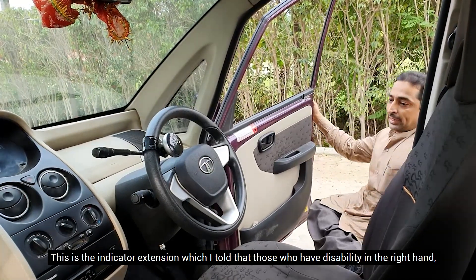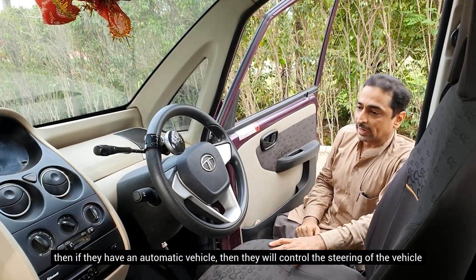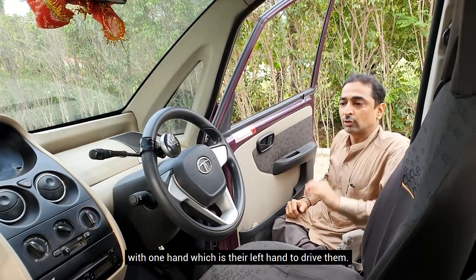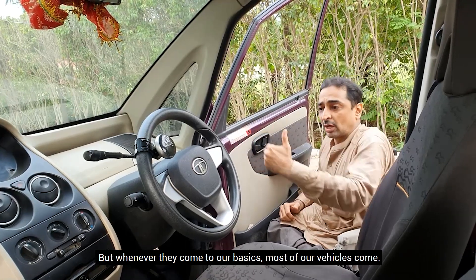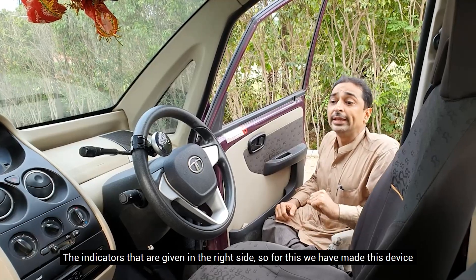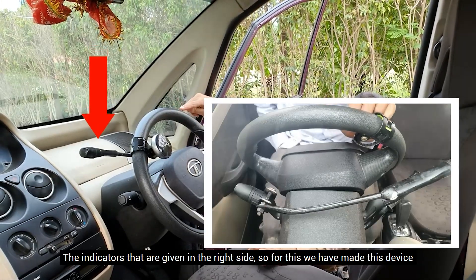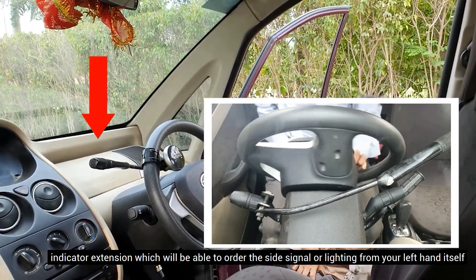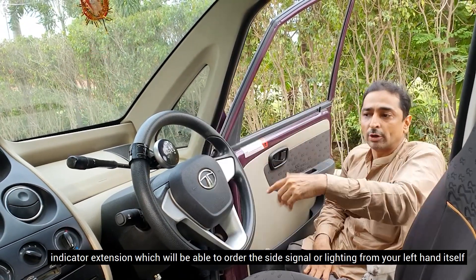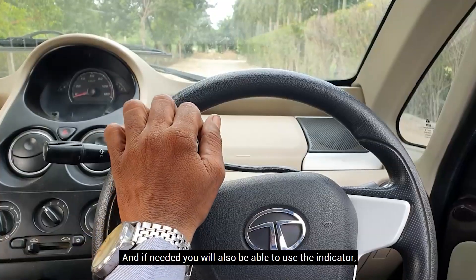This is the Indicator Extension Device, which I told you about — for those who have a disability in the right hand. In an automatic car, one hand — the left hand — will control the steering wheel. But the indicator on the steering wheel is positioned on the right side. So for this, we have made the Indicator Extension Device, which, on the left hand, allows you to control the side signals and lighting, so you can easily drive and also use the indicator.